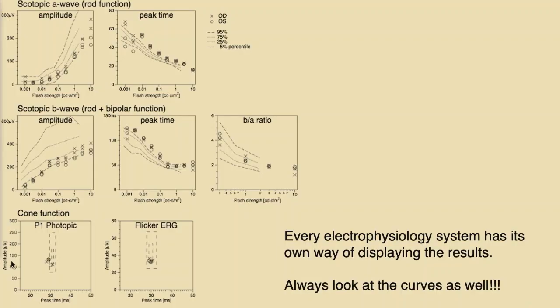So understanding reference ranges is also something that I quickly wanted to look at. This is how we plot our results. We also add additional sheets with the actual curves so that everyone can look at the curves, but that's kind of the summaries. And our doctors always tell me they only look at that, and then I always tell them also look at the curves, but they don't do that.